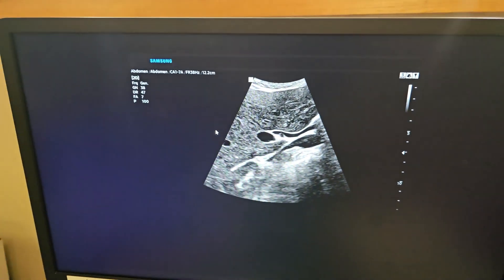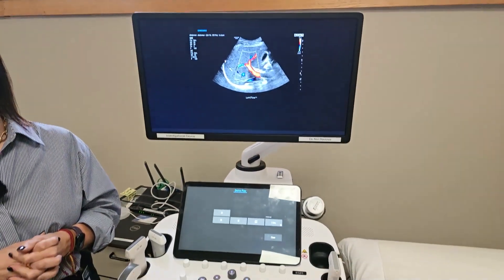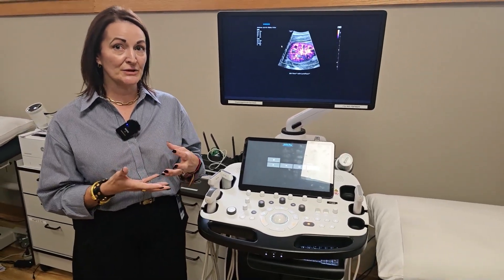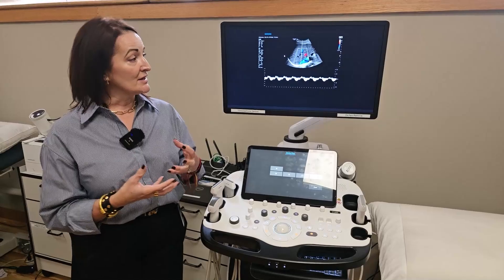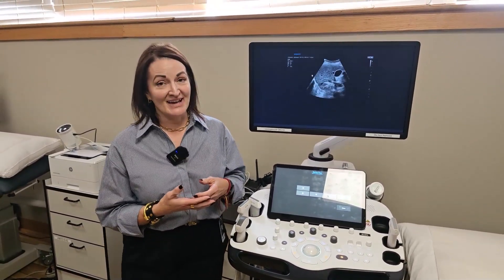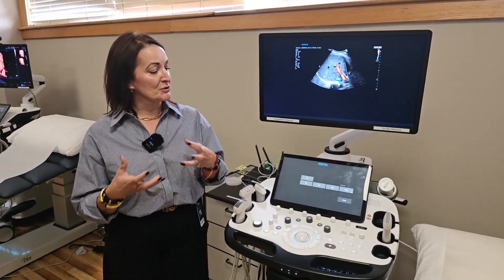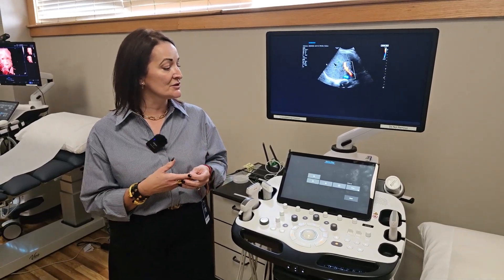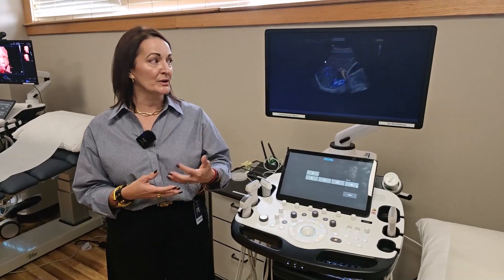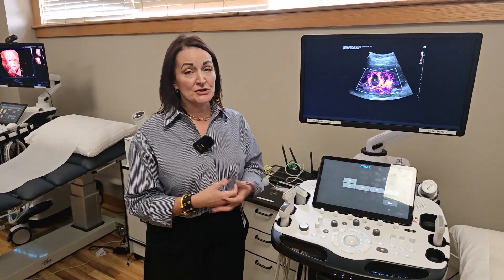I see that some of these images have color. What is the technology that allows color on an ultrasound? Color Doppler essentially gives directional flow through a vessel color so you know whether it's coming towards or away from the transducer. Different organs have certain parameters that are industry standard, and there are specific things about this product that really excel at helping with vascularity in areas where sonographers typically struggle.